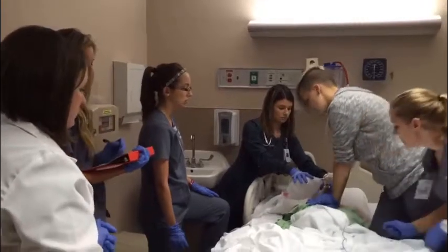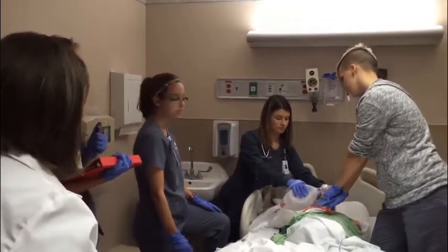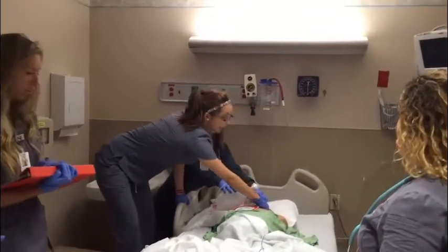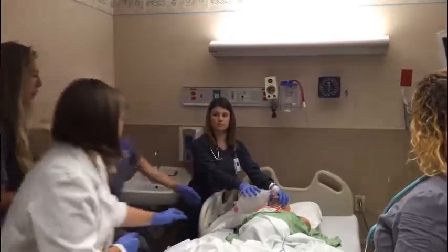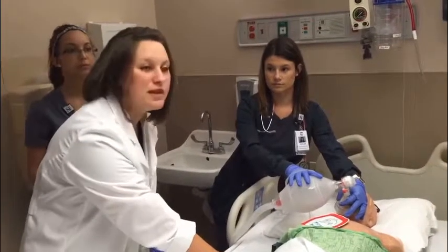1 milligram of epi given. Second round of epi given at 0804. It's been 2 minutes. Let's check the pulse again and switch compressors. I've got a pulse. Can I get someone to confirm it? All right, I have a pulse. Good job, team. Let's initiate hypothermia protocol.